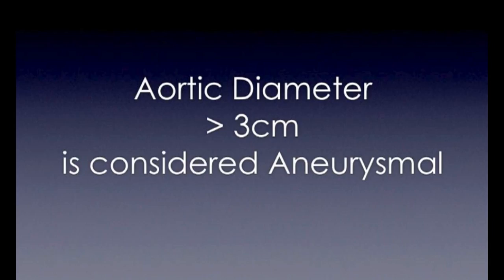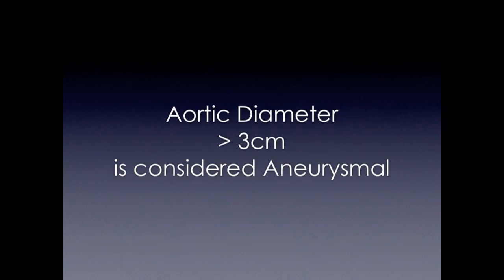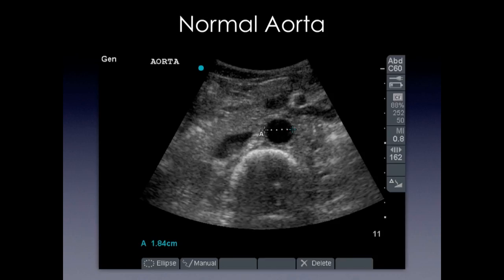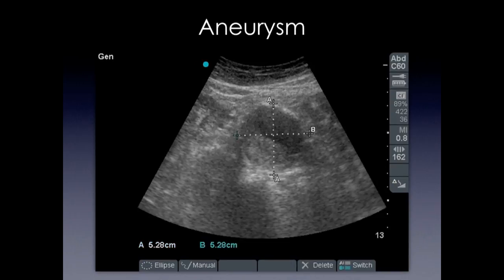When we measure the aorta, we want to make sure it's no greater than 3 centimeters — anything larger would be considered an aneurysm. Here we have a 1.84 centimeter diameter, which is pretty normal. And then we have another patient that clearly has an aneurysm: by definition it's greater than 3 centimeters, and it measures 5.28 centimeters.